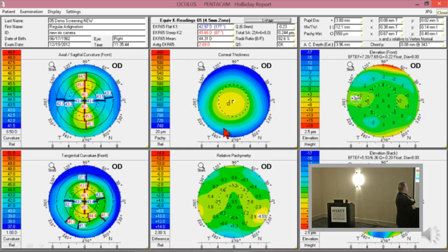are, it's also got a Q value, it's got the spherical aberration, it's got the ratio and the corneal power of the map. Now, the Q value you really don't need, because the spherical aberration is the number that in microns is how you choose the right aspheric intraocular lens. Okay, there's only 3 in the United States that are available right now anyway. They're the 3 companies that make the aspheric lenses.